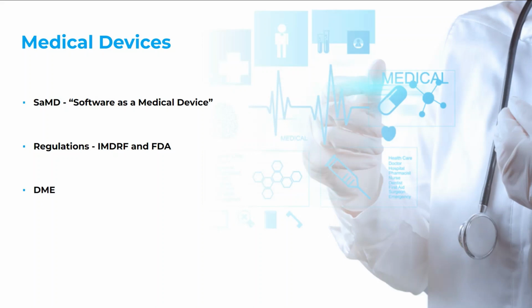That means the software itself is the medical device, not the device that's being operated. We could explain that a little more in a future slide. I'm not going to get into the IMDRF definition because it's very similar, but it's a little more complicated word-wise.